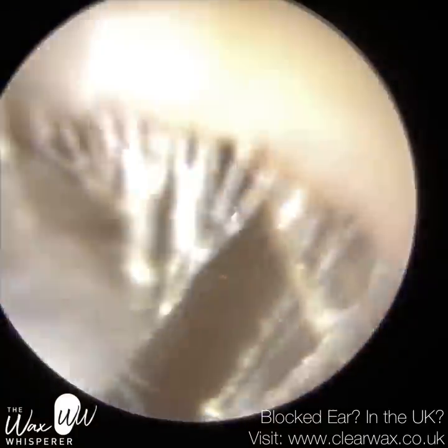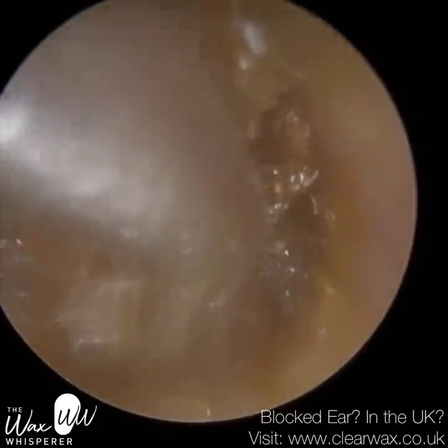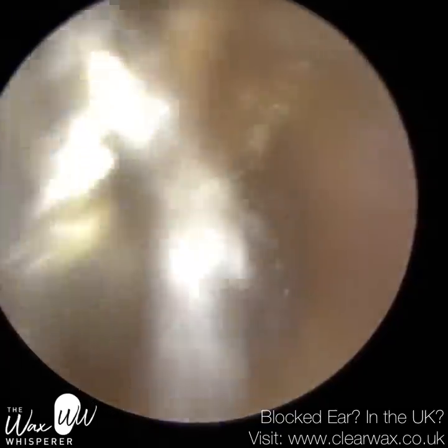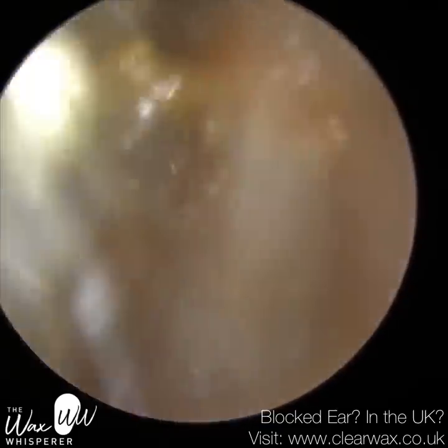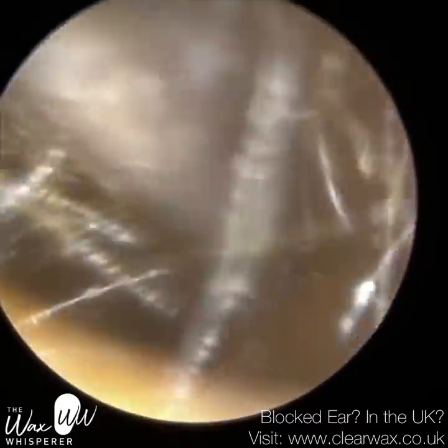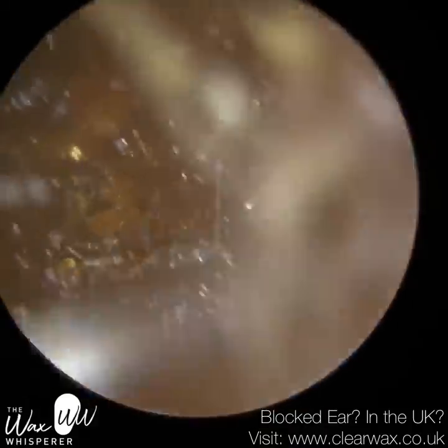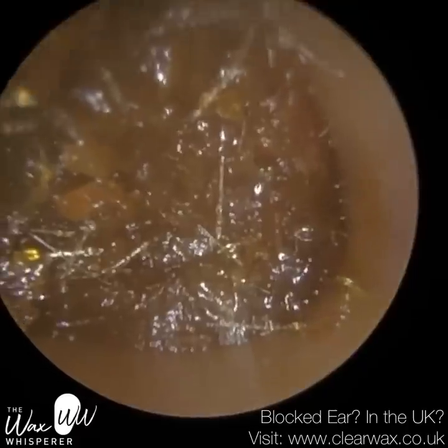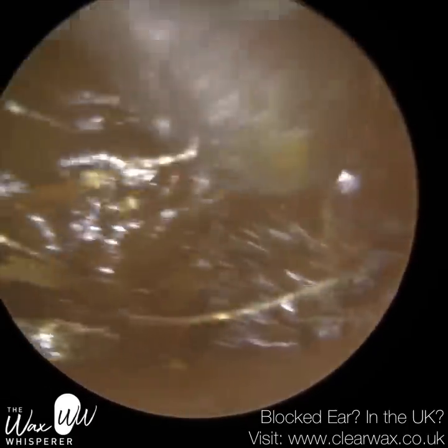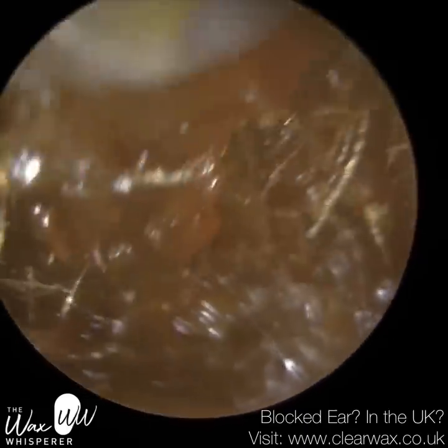Now, what I've done is I've removed the outer half of this wax plug, but the inner half is quite sticky. I've instilled some olive oil drops just to change the consistency. But when you've got this type of wax, it can be quite tricky to remove because it sticks to the inside of the suction probe and also sticks to the canal wall — it's almost like glue. The olive oil helps to bind the wax together, remove some of the adhesions, and it lines the inside of the suction probe, reducing the likelihood of the suction probe getting blocked.